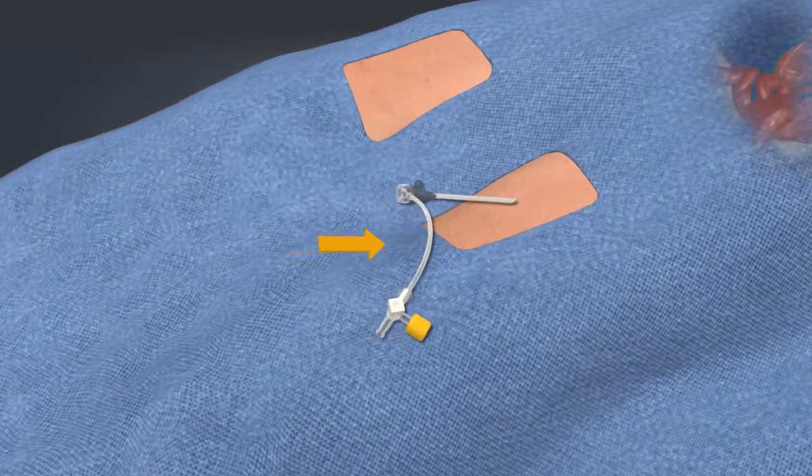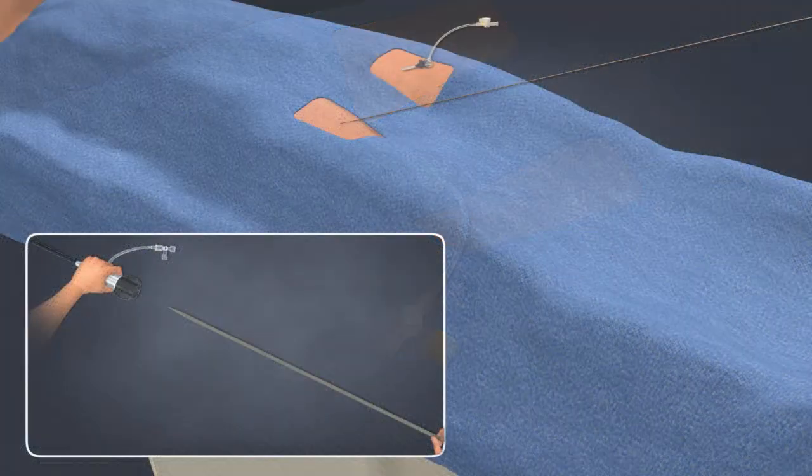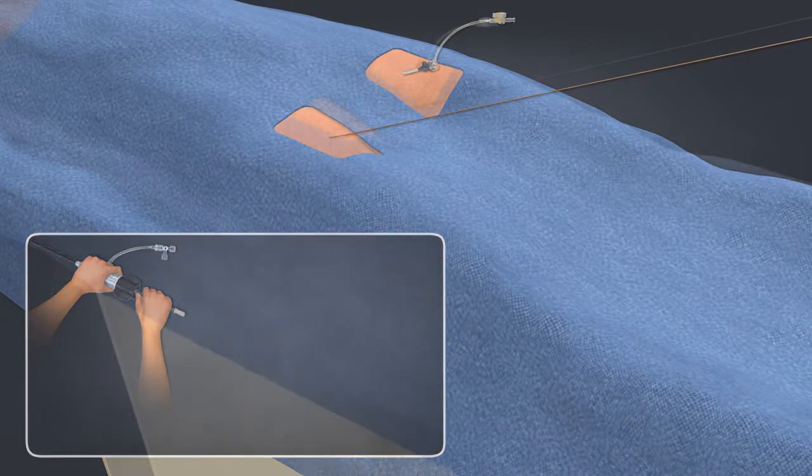Place a 9-French sheath on the contralateral side. Place the dual lumen dilator fully into the introducer sheath.